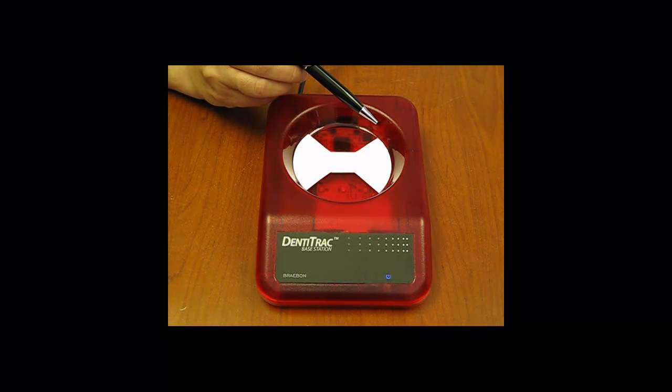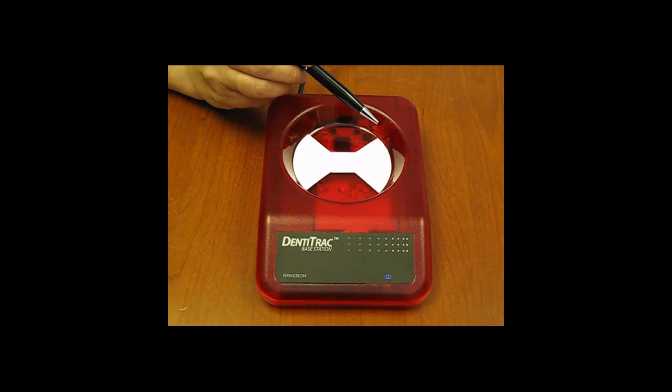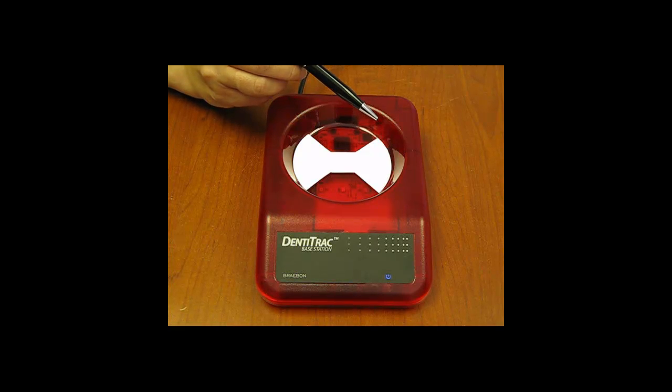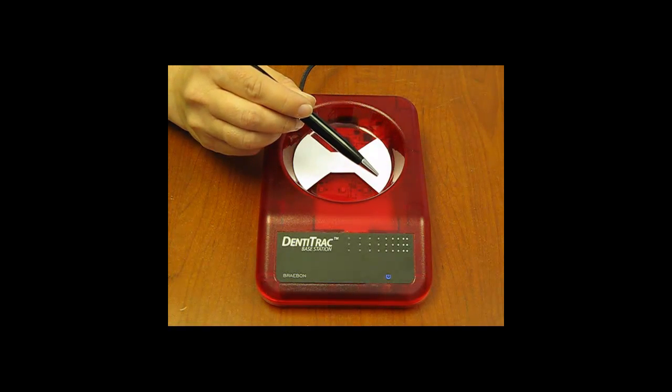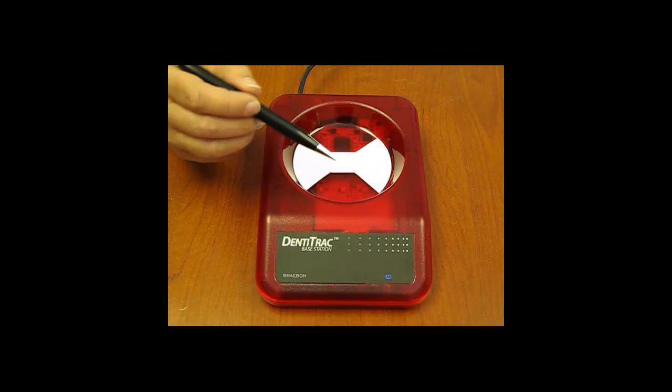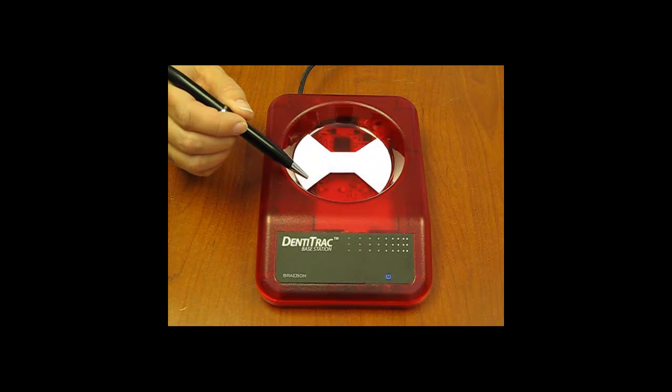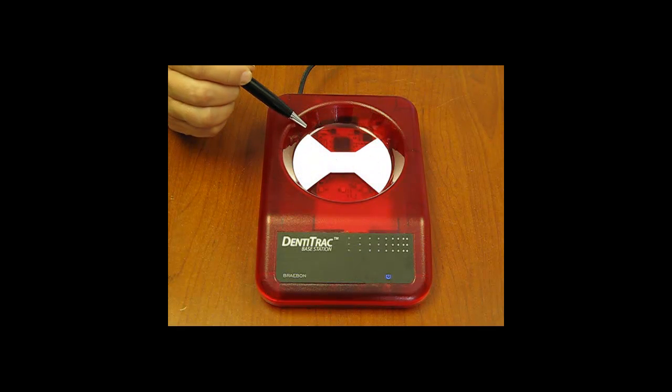Number four, the base station has two sweet spot zones. One is between 2 o'clock and 4 o'clock, and the other is between 8 o'clock and 10 o'clock.